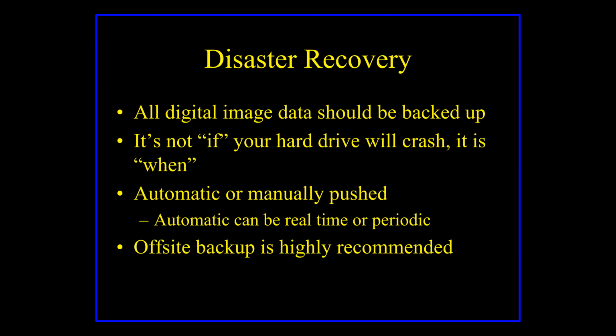Okay, so most of the people that back up their PACS, their PACS system will do it to a PACS server, a specific radiology PACS server, and you back them up. And that way, if your system crashes, you can get all of your images back, and they're still unchanged, the same quality with the same names, and you can still search by them, catalog them.